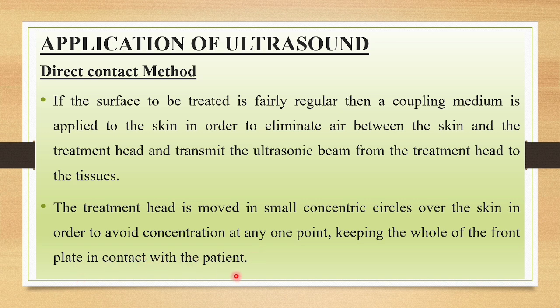So we should not remove the contact between the skin and the ultrasonic head, because if you keep the ultrasonic head in the air, it may reflect the ultrasonic waves back to the crystal and finally lead to damage. In order to prevent that, we should always keep moving, either in a circular manner, or a figure of 8, or transverse strokes.